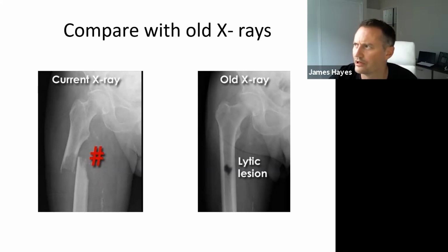There's a drug called Fosamax, which is given to a lot of people who have osteoporosis or osteopenia. And it's a wonderful drug most of the time. The problem is when it's not wonderful, it can give you a new buildup of bone along the proximal third of your femur, and it usually happens bilaterally. It comes out as a lateral beak about here. And when I say beak, I mean like a little canary, just like a little triangle. So you'd see it on a pelvis, and you'd see it on a femoral x-ray, and there might be in there for a completely different reason.